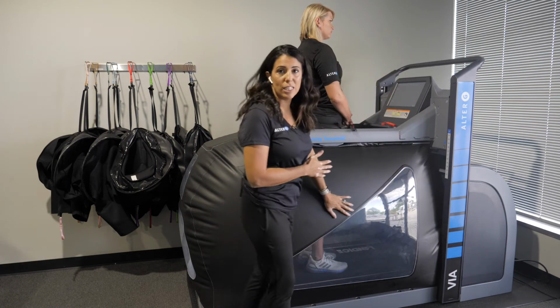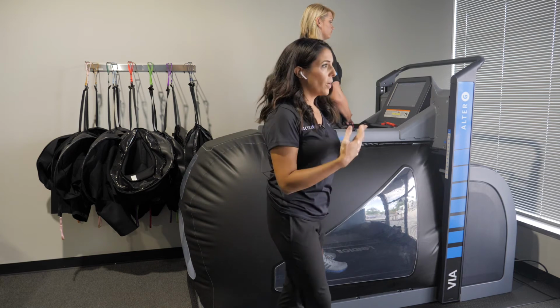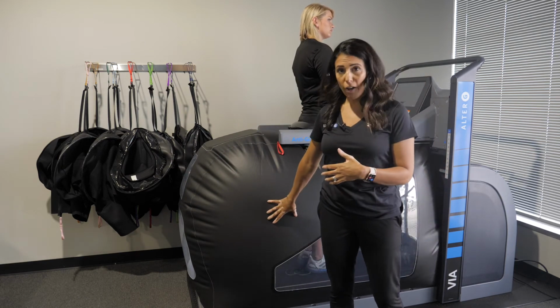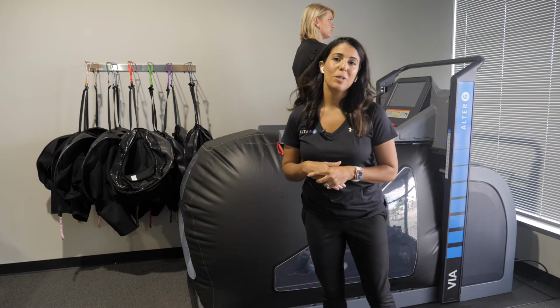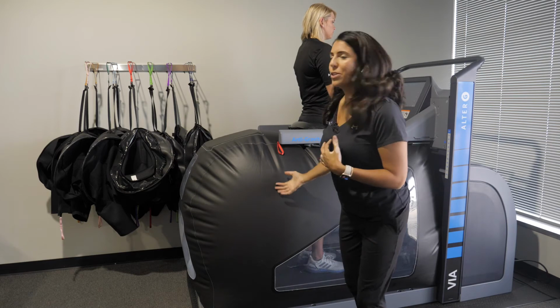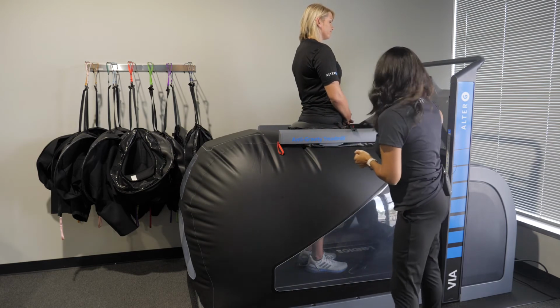Once I have her in a nice fall safe environment, I can start the treadmill. I can either start working on walking, I can start running, we can start doing exercises with the treadmill off. Here's where the capabilities for treatment are really up to you, the clinician, and what your goals are for using it. We're just going to have her start walking just so you can, again, see it in use.